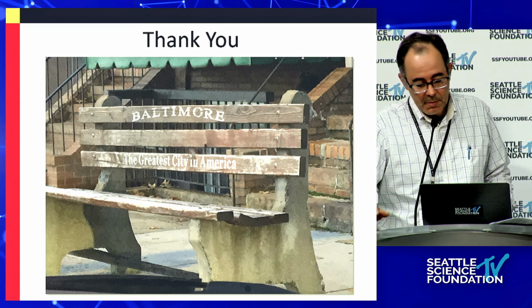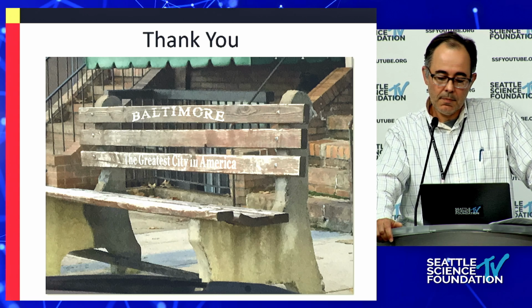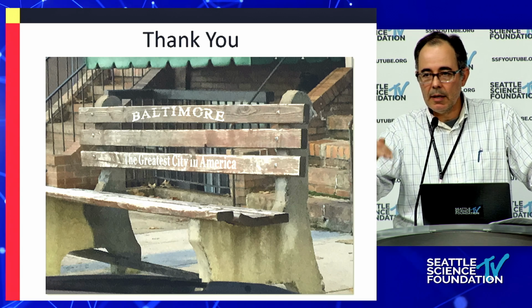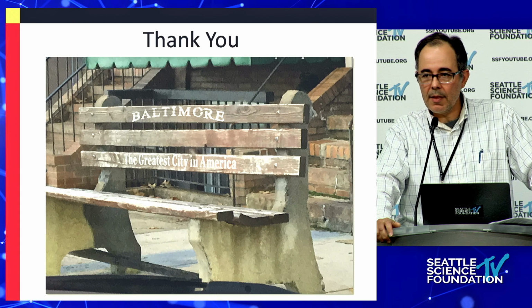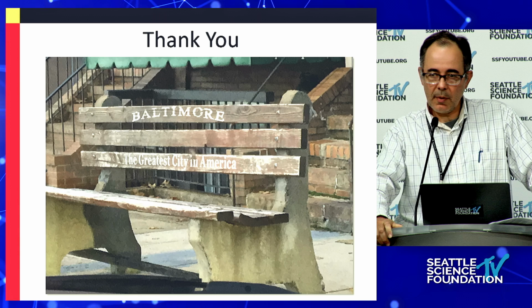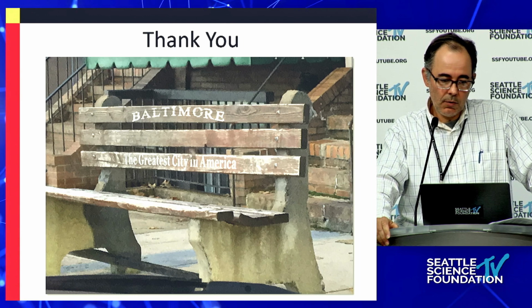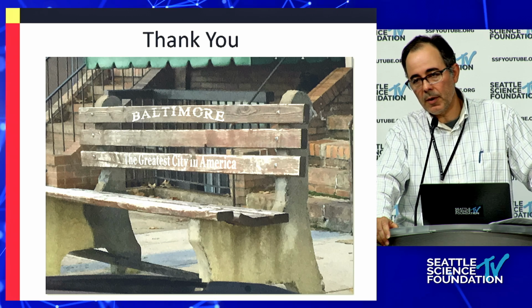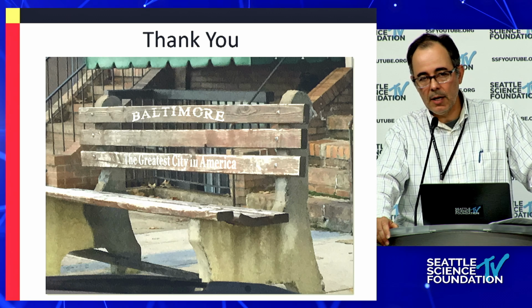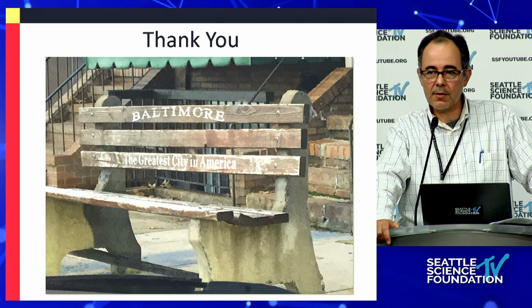Yeah, I've certainly done that before. Arthroplasty adjacent to a fusion. My preference is to do the arthroplasty above the fusion and not below, because I feel like if the fusion is above it, it may overburden the arthroplasty. That's just my overall interpretation. I've done that before, where the patient has had a fusion and I've done an arthroplasty above it. But I would choose the most stable version of the arthroplasty, which in my opinion is the ProDisc.